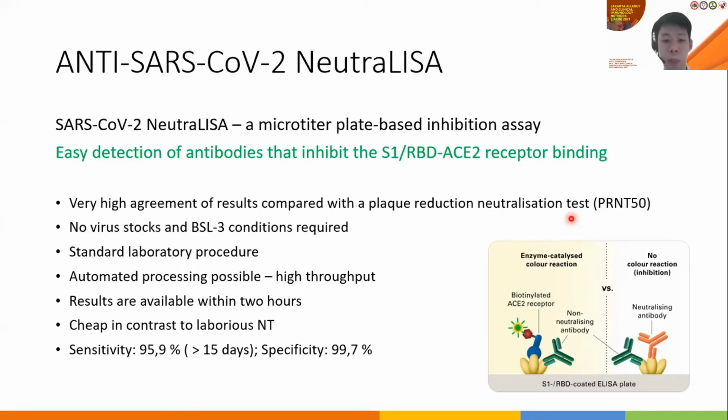It's also cheap compared to the conventional PRNT50 test, and it does show high sensitivity as well as specificity for our neutralization test.